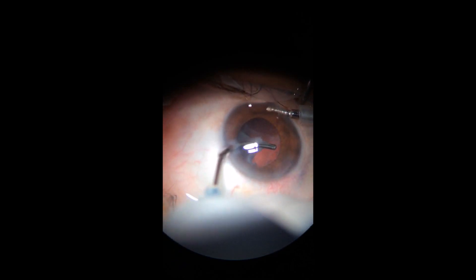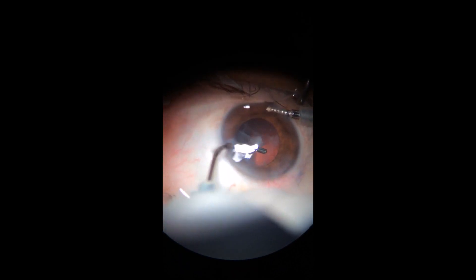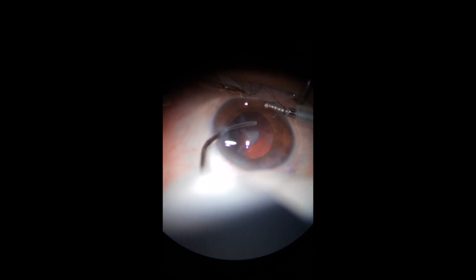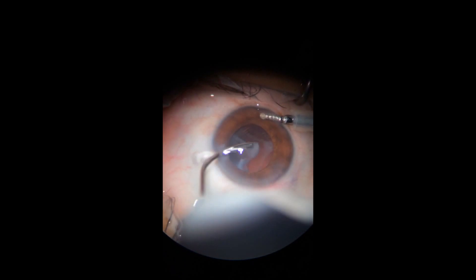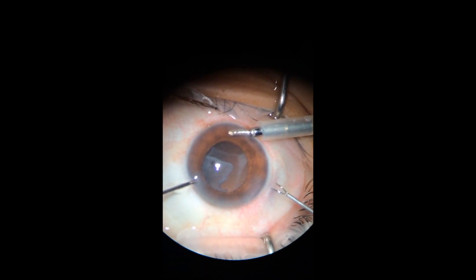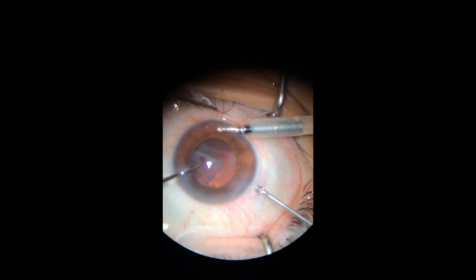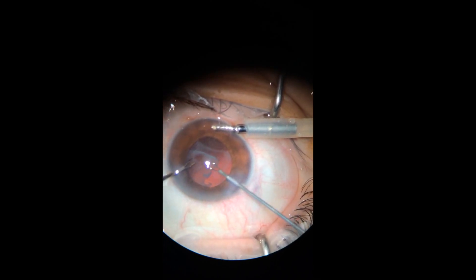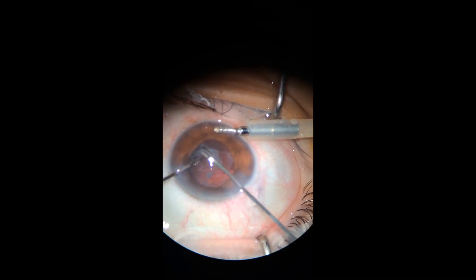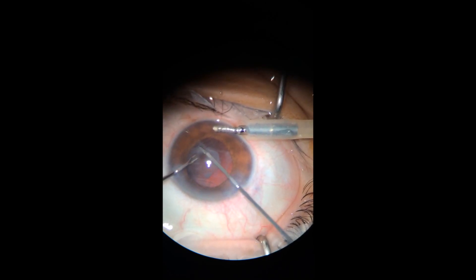So I stopped doing that. I aspirated the cortical matter with the aspiration needle. The posterior membrane was also fibrotic, and with two Utrata forceps — this time the serrated tip — I tried and finally succeeded to break it off and remove it.